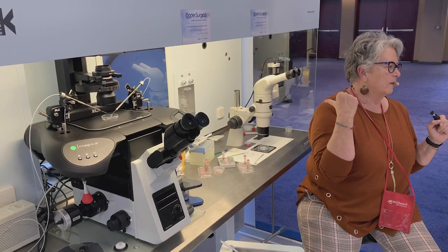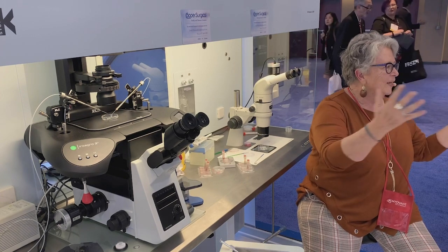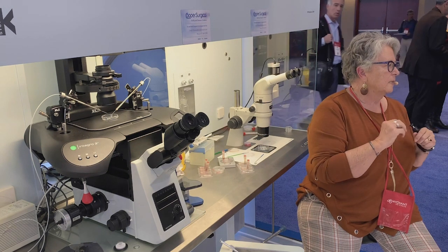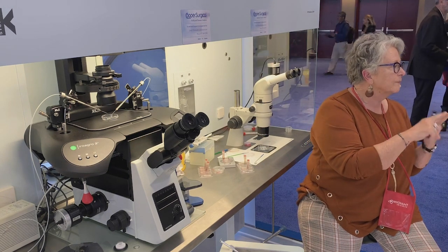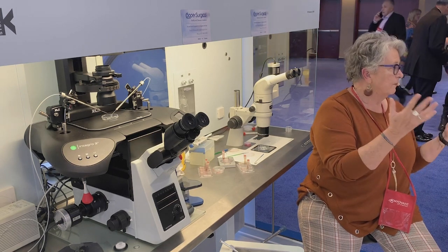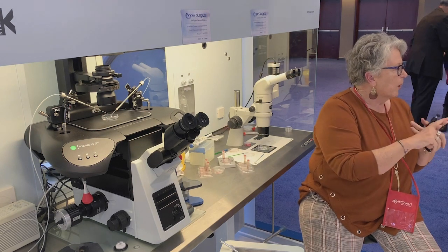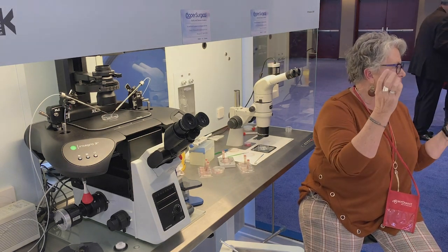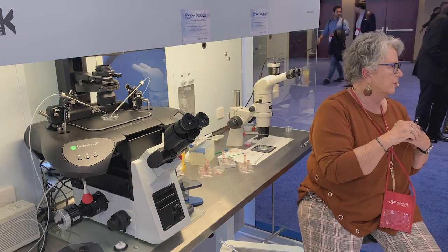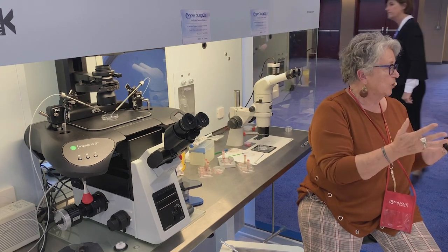Same thing is going to happen with a VitriGuard, which is nice for me because we ship embryos around the U.S. a lot. That's very common. And we've gotten a number of devices that have come in either broken or the embryos aren't on there, we can't find them, and I believe that the person who's sending them to us sent us embryos. But when you get a broken device, devices that come in with the caps dislodged, or devices that are sort of curled up in the bottom of your goblet, to me that says there was a problem potentially in shipping.